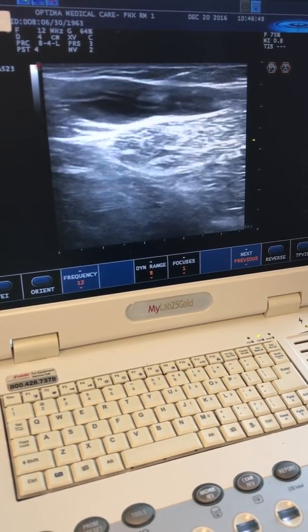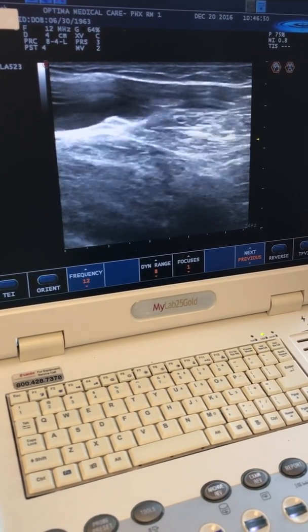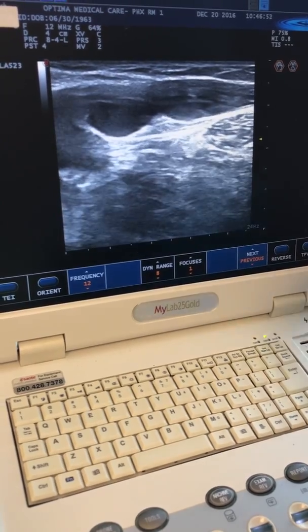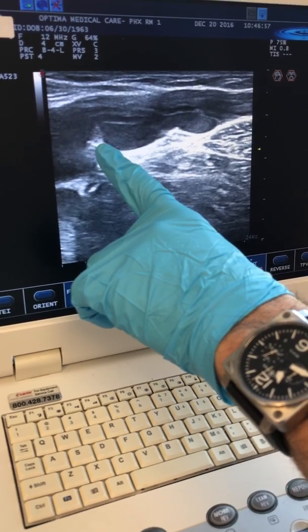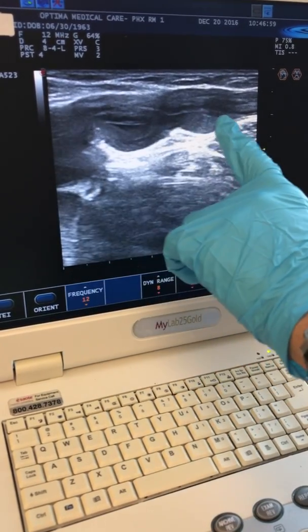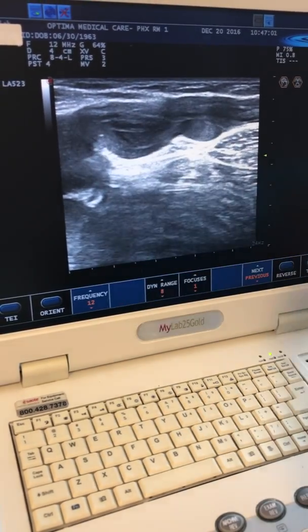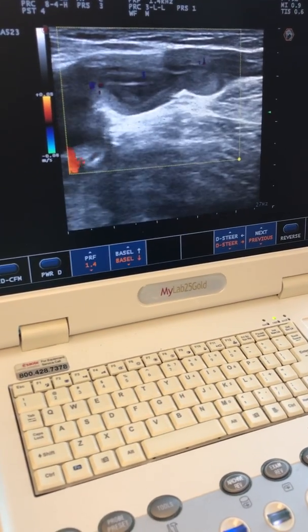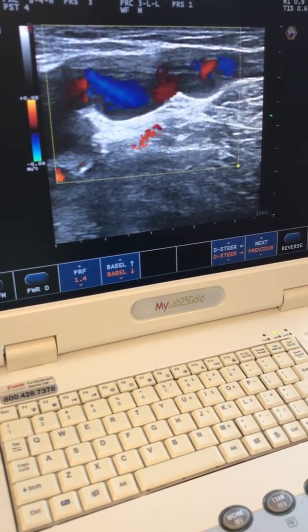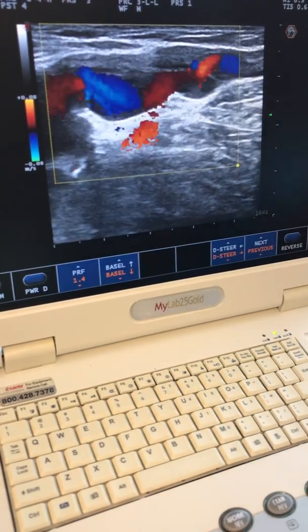That's broken, and the vein has gotten really big. You can see these valves on the side here — a really good picture on this patient. There's one here, this has that last valve, then this other one here, so the blood's going through and coming backwards through these pipes. We're going to close this pipe so that the blood is not — you can see the blood is just coming back through here.